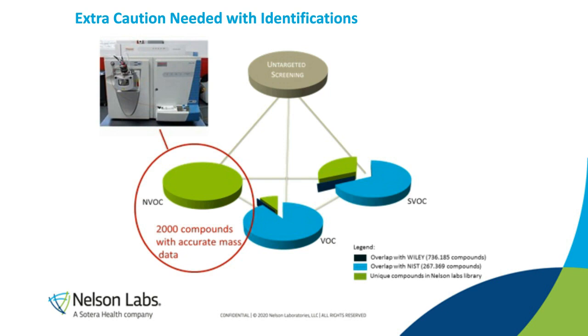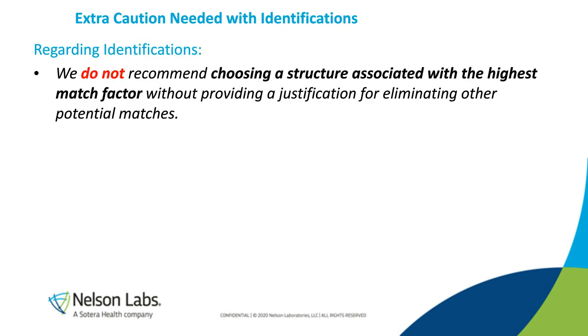And so when I think about this, I think there are really different levels of quality of identification that you can think about, where the lowest level of quality is where every compound called out is just whatever the highest match was using an automated process. One step better than that is already a lot better. That's if you have this whole automated process, but then an expert in chemistry peer reviews and checks that and weeds out all the ridiculous, crazy matches.